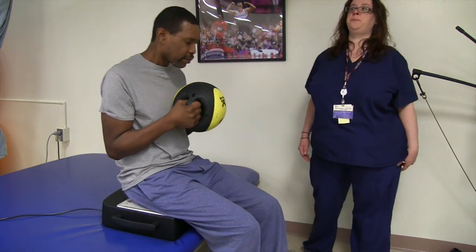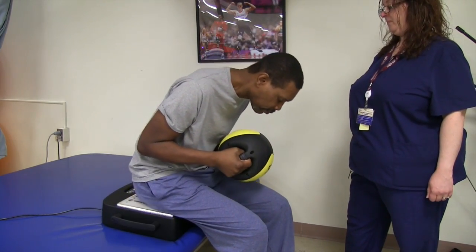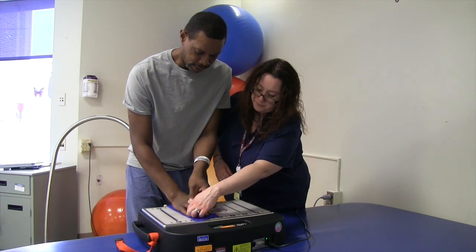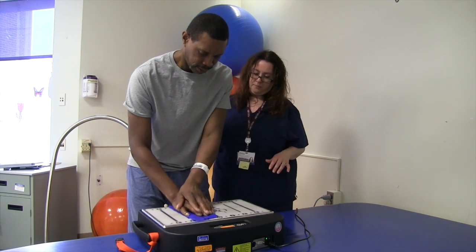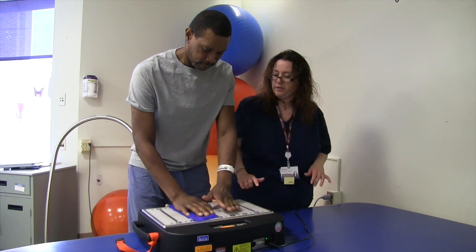Five seconds — good. Take a break. This will help — just keep your hand on it. A little bit better. Okay, this way you could separate your hands. Okay, once you flatten it and get it on there, I want you to put the left hand there.